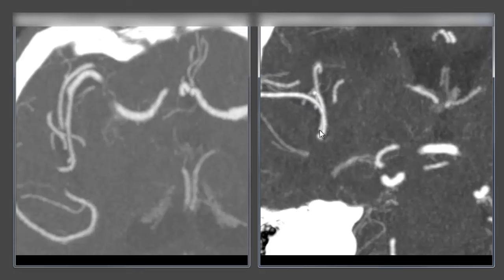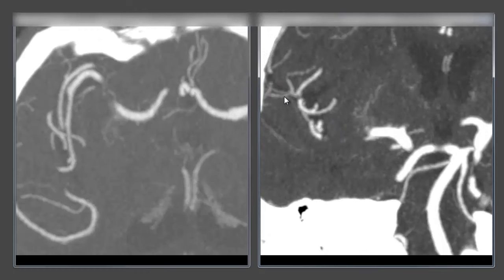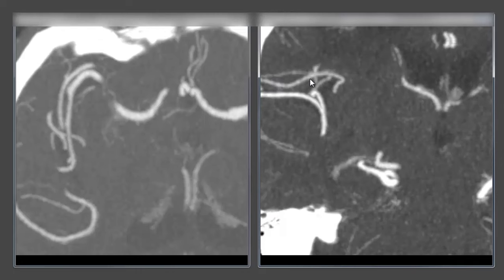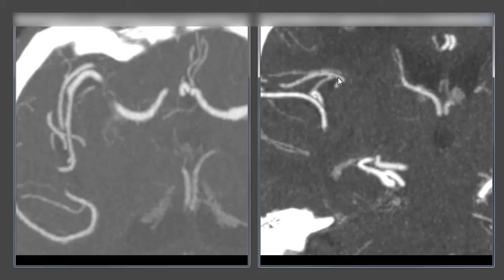Here is a clear example: M2 takes a turn, then M3. These are all M2 branches with smaller M3s, and farther back an M2 branch coming up. Once it takes its turn and moves medial to lateral, we're in M3. Once you hit the cortical surface, those vessels visible on the cortical surface are all M4.